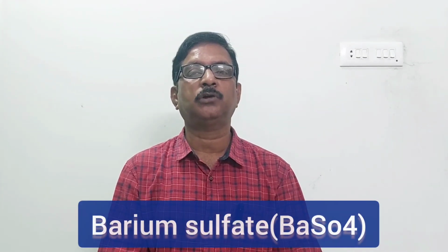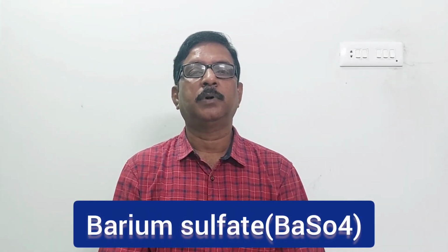Hello students, today I will discuss the contrast X-rays of the gastrointestinal tract, and the commonly used contrast medium is barium sulfate solution. The barium sulfate solution is prepared by mixing water, about 180 to 200 ml, with 120 to 130 grams of barium sulfate. Thus the barium sulfate solution is prepared.